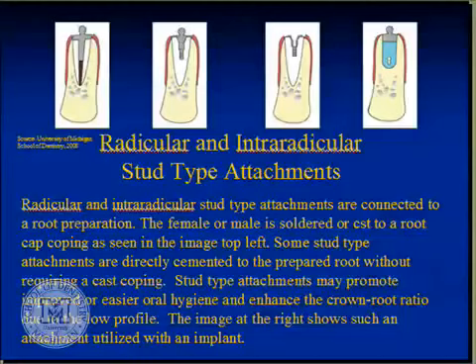If one looks at either a tooth or an attachment, or an implant, you can see if a tooth has been endodontically treated ahead of time, one can either use, if you're going to use one of these stud or individual tooth type attachments, they can either stick outside the tooth or they can have a negative that goes down inside the tooth. So this was called the original Zest anchor, and it's the same with the implants. Then you have some sort of little ball or clip on the implant. I tend to prefer these types of attachments, but I don't like the ball attachment. I like the Zest locator.